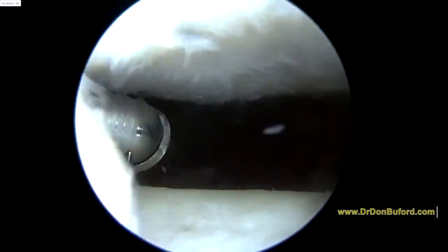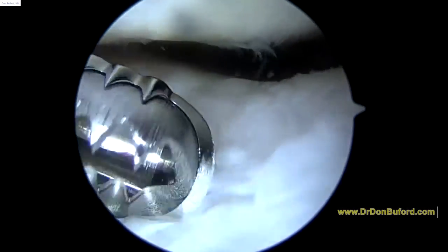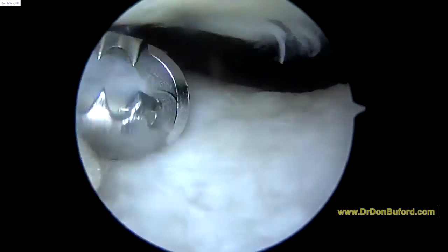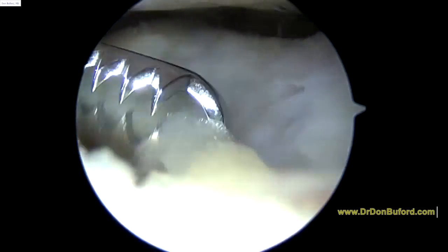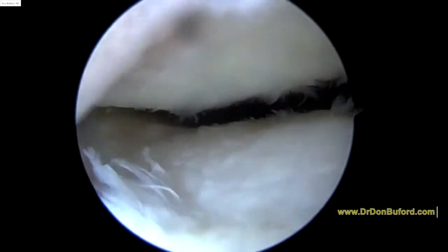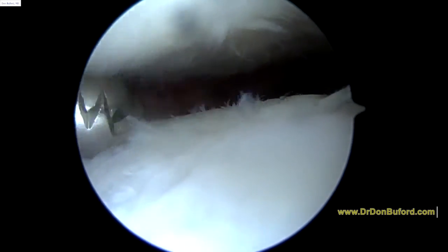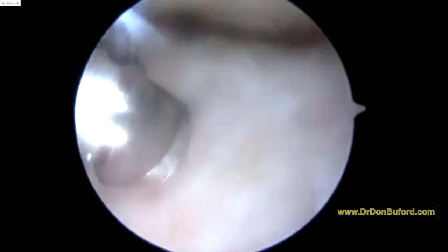We're looking at the patella now — that's your kneecap at the top of the screen. And where the shaver is, is the part of the knee called the trochlea. You can see there's a fair amount of wear and tear changes here, and this can cause a lot of symptoms too — especially some of the ones you were describing, because it's right in the front and middle of the knee. Going up and down stairs, or first thing in the morning, or after sitting for a long time, this is the area that can get stiff. There's arthritic change like we're seeing here.